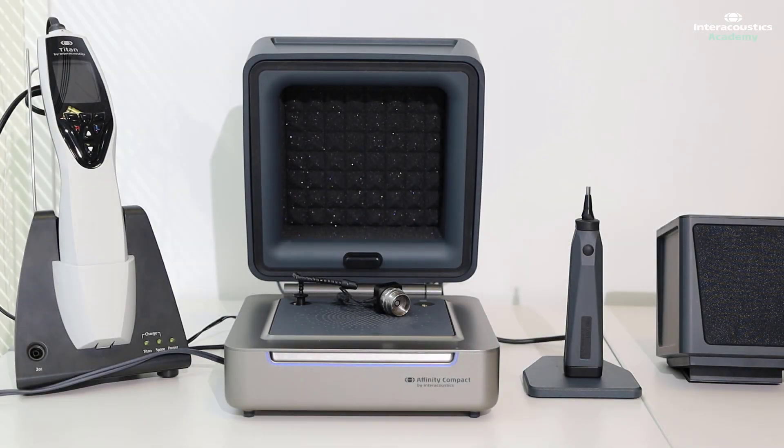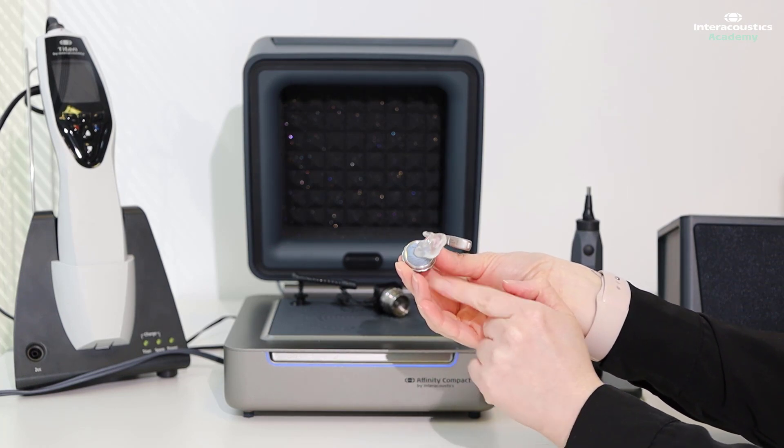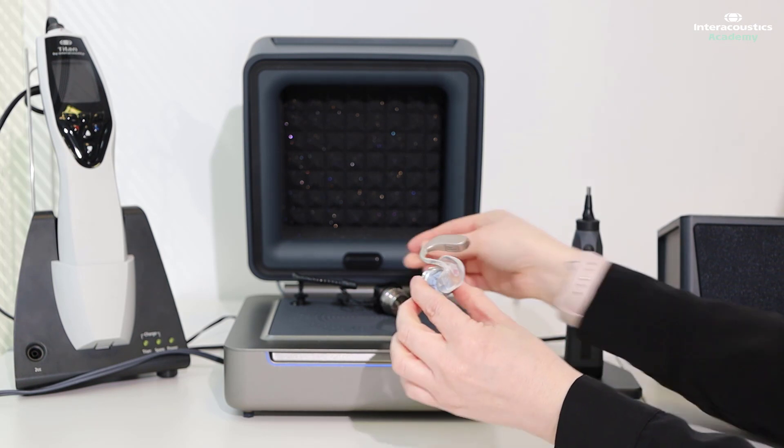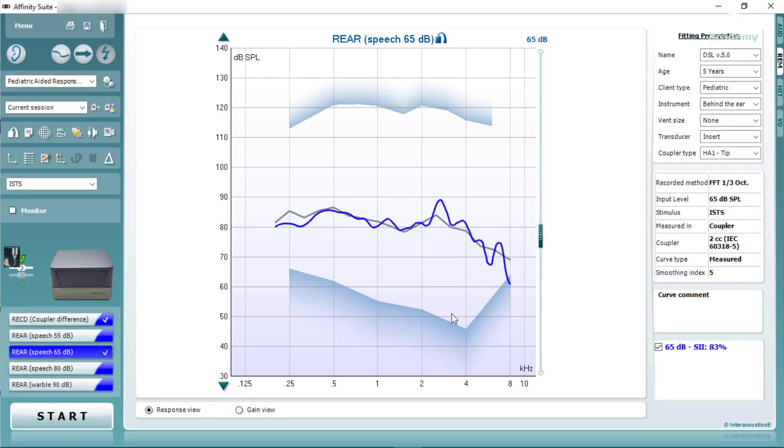We're now ready to insert the hearing aid into the test box. Because the RECD was measured using the SPL60 probe, we need to connect the hearing aid to the ear molds and then use acoustic putty to attach that to the HA1 adapter. This is then connected to the coupler, and we're ready to run an aided response at a level of 65, which is a moderate speech intensity, and verify the hearing aid.